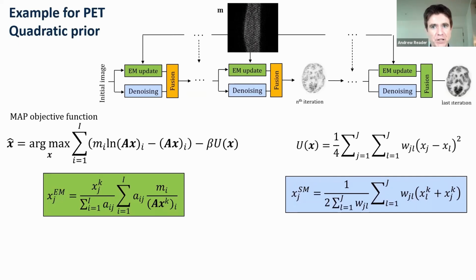That gives you the overall denoised update that is, if you like, using this surrogate-like function for optimizing the actual function that we want to optimize. So quite involved theoretically, but what drops out is actually incredibly simple to work with. So the data-based update, and the update based on minimizing that energy.